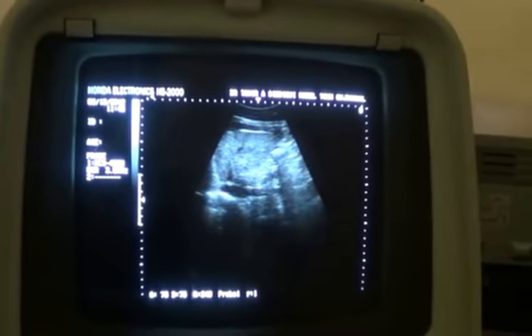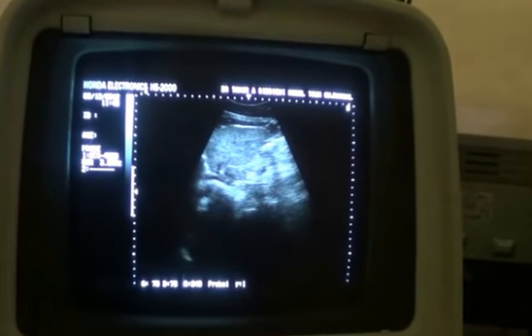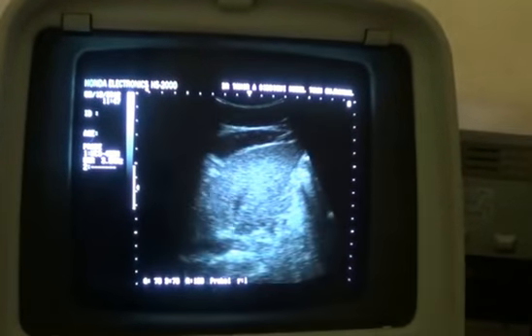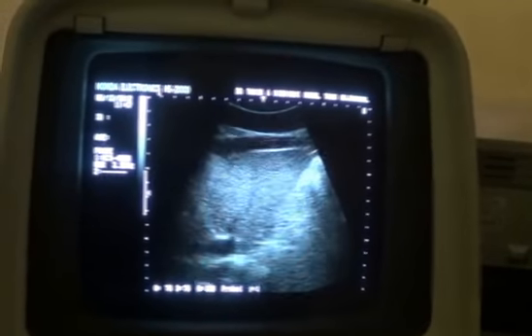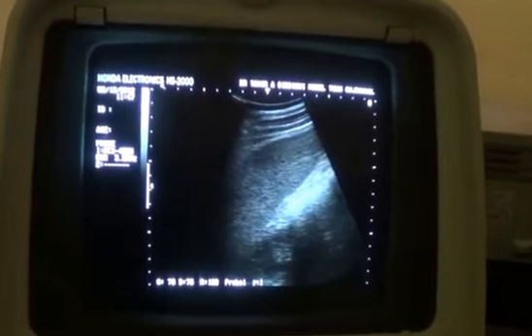Now this is segment 5 regarding the evaluation of the liver span by real-time ultrasound. Now this is a liver which is seen below the costal margin when I give a sweep to the probe below the costal margin. I place the probe in this direction and then I give a sweep down up to this level.